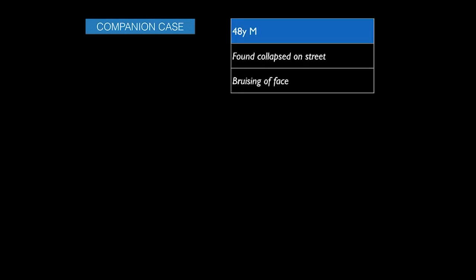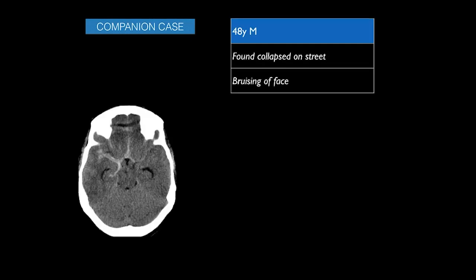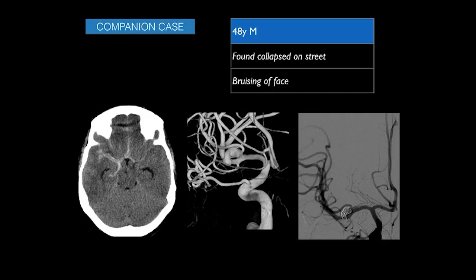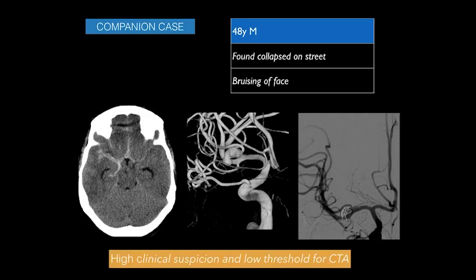A companion case illustrates this point: a 48-year-old male found collapsed with facial bruising. CT showed bleed along the medial temporal lobe margin extending into the anterior interhemispheric fissure — not typical for trauma. A CT angiogram demonstrated a right MCA bifurcation aneurysm requiring urgent treatment with coiling. In cases where the blood distribution is atypical, maintain high clinical suspicion and a low threshold for CT angiogram.